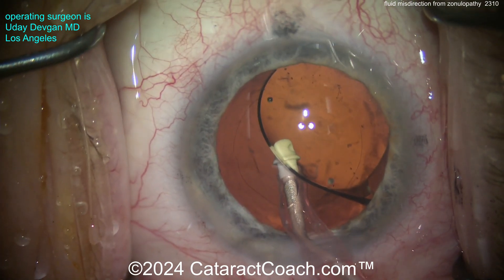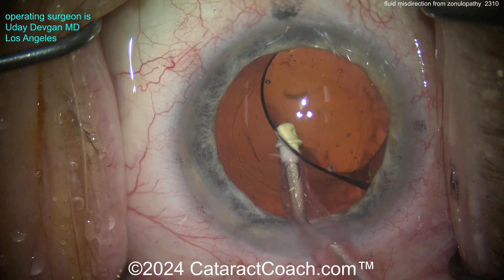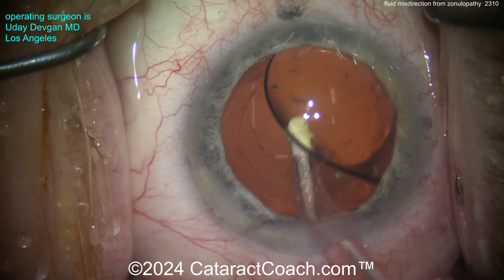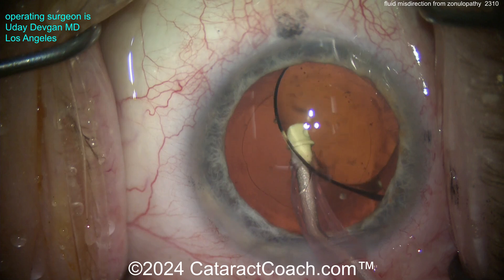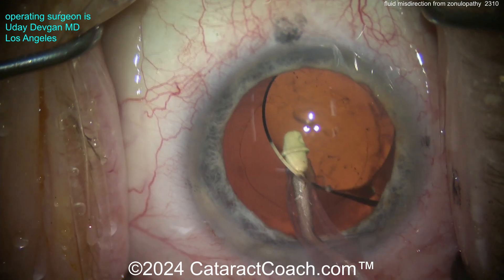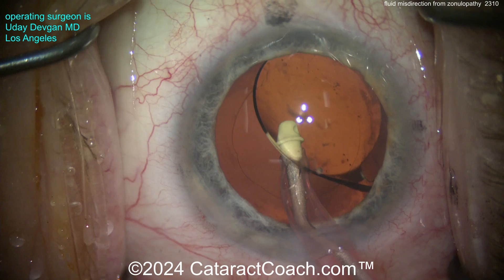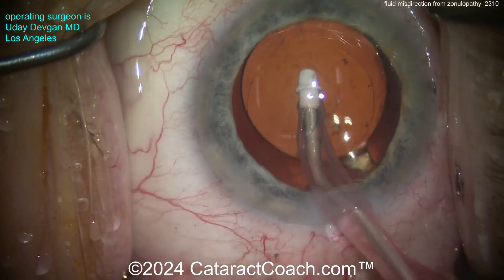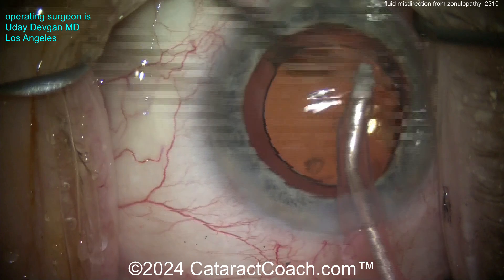Behind the optic, removing viscoelastic nice and slowly — as I remove the viscoelastic I really can't get those pieces. The question is: what do you do here? If there are large pieces and there's a posterior capsular rent, you can't leave those — the patient is going to need a vitrectomy.